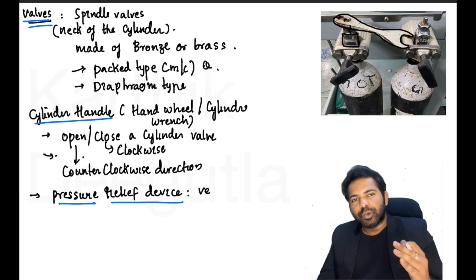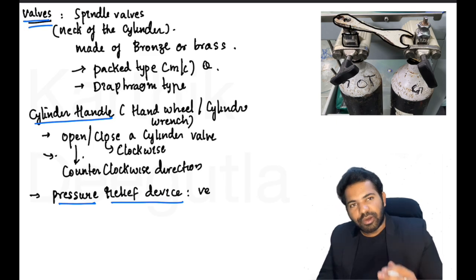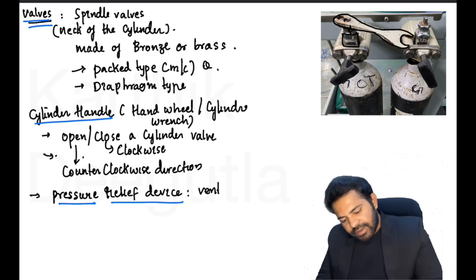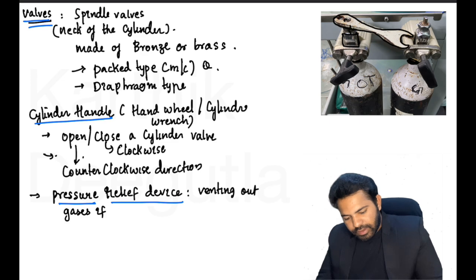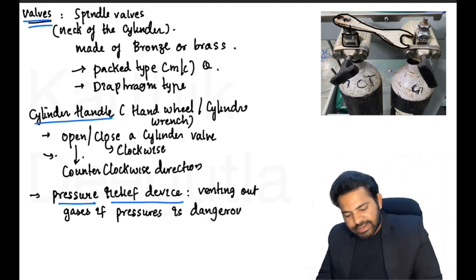If the pressures are too high, it will help in venting out the excess gases if pressure is dangerously high.